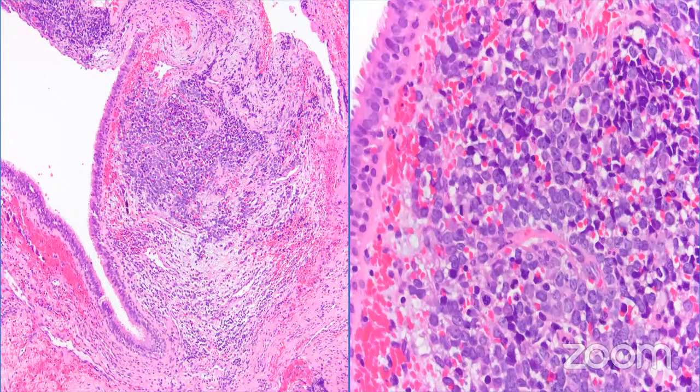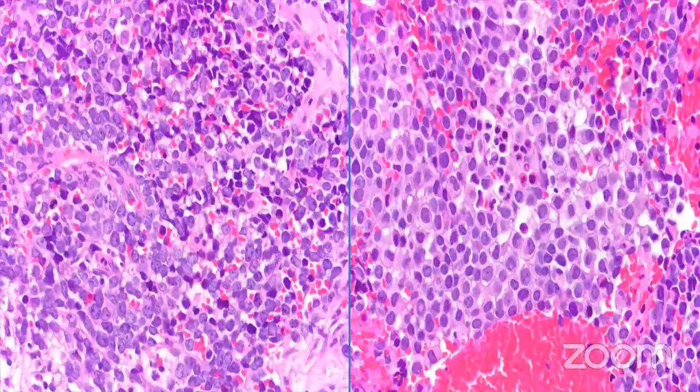Morphologically, this is an example of a solid variant of alveolar rhabdo. It's composed of the same cells, essentially primitive appearing, small round cells, but there is no hint of alveolar architecture. It's a solid growth of the tumor.